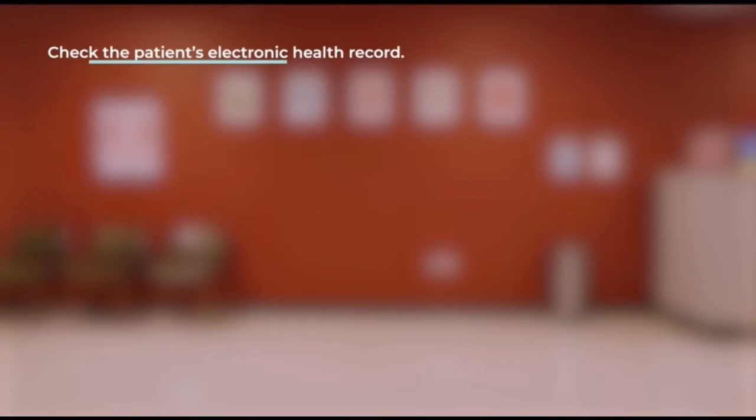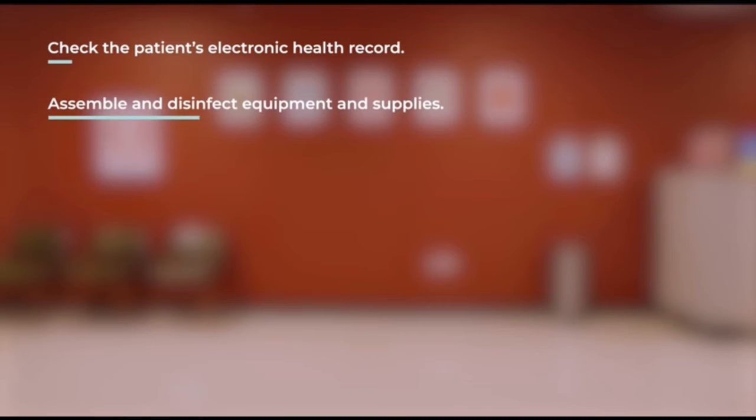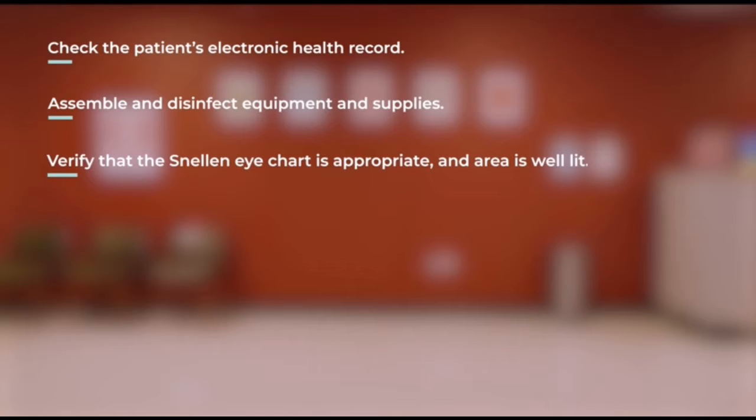Check the patient's electronic health record to understand the reason for their visit. Take note of any past history of visual conditions. Obtain and disinfect the eye occluder if it isn't disposable. Verify the Snellen eye chart is appropriate for the patient you're assessing. Secure it in a 20-foot area that's well lit and free of obstacles.